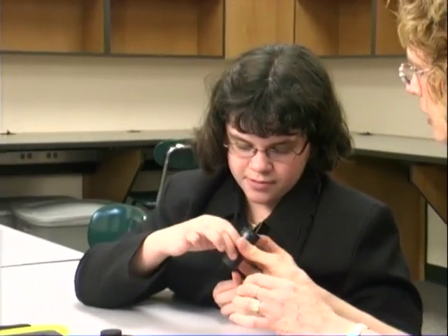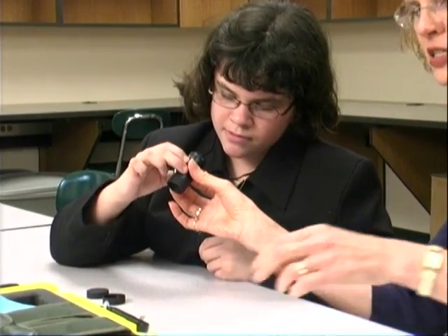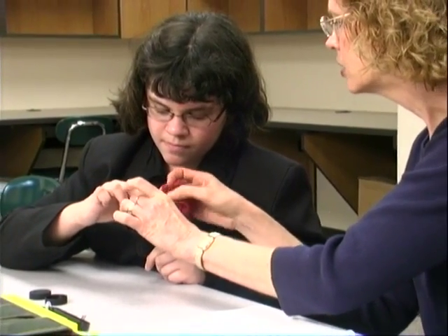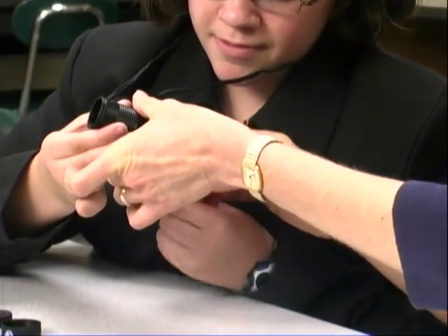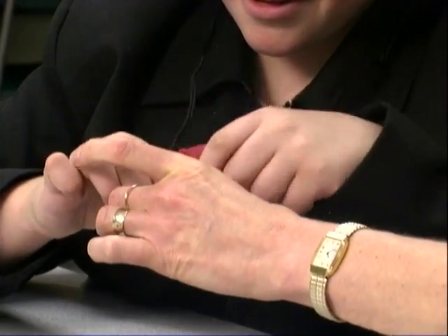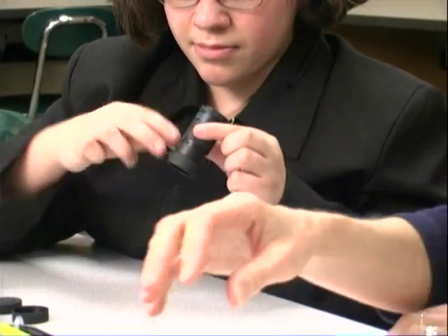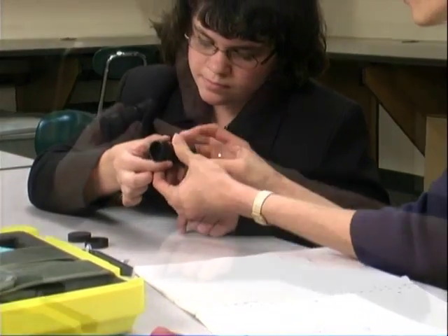Let's clean it — just eyeball it and make sure there's no dust on it. You can take this and just lightly rub it. The part of the monocular that is closest to you is called the ocular end.